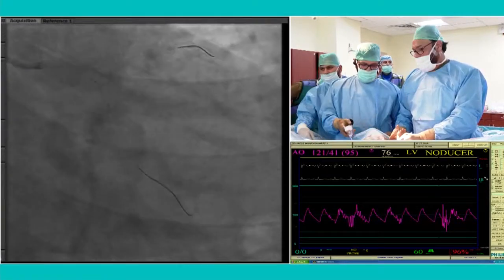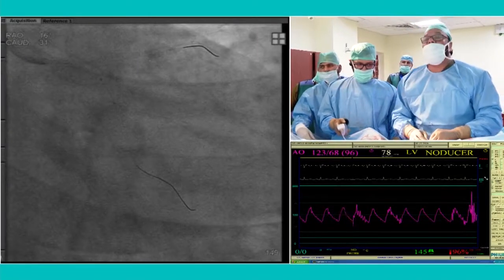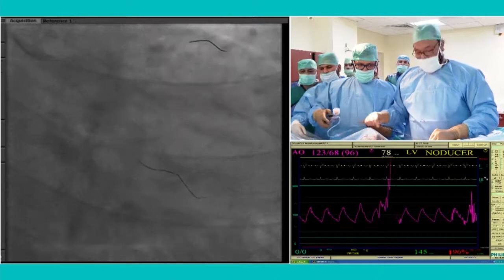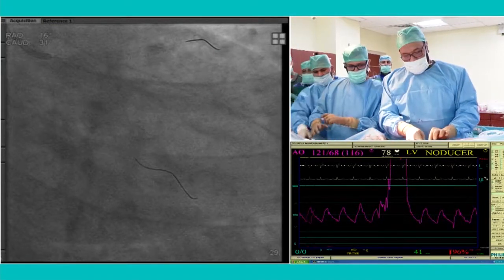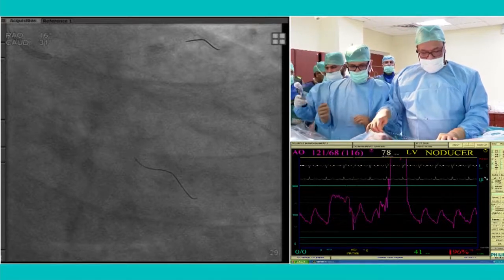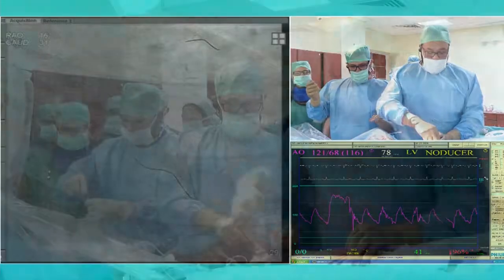And this is a 2 millimeter balloon. We'll just see whether we need another bigger balloon to do it. Dr. Sandhu, when you prepare the lesion here in circumflex before the TAP stenting, we will go to the other lab and come back in 10 minutes. By that time, you should tell what other things happen during this time. Sure.